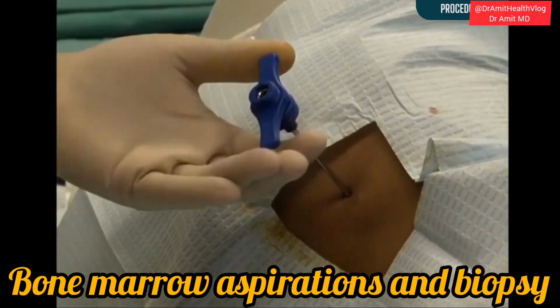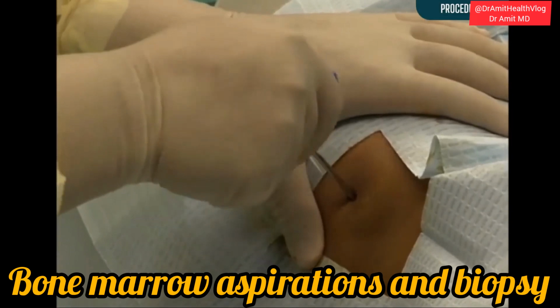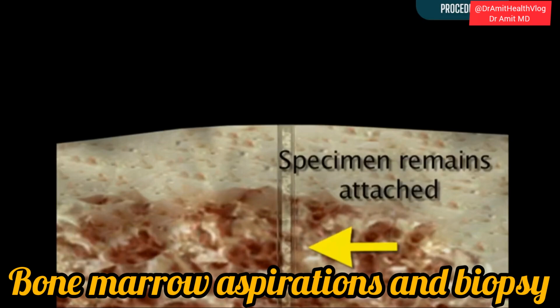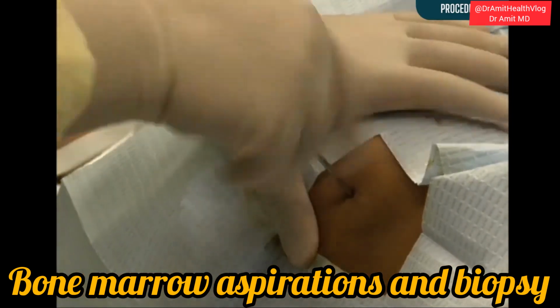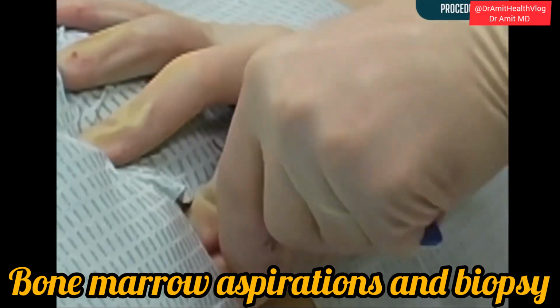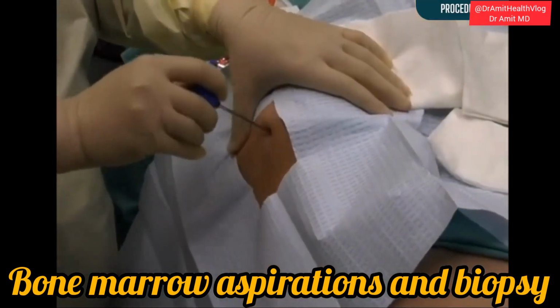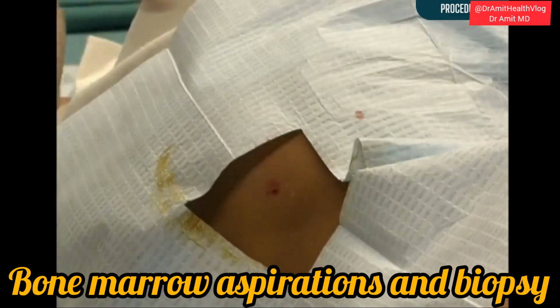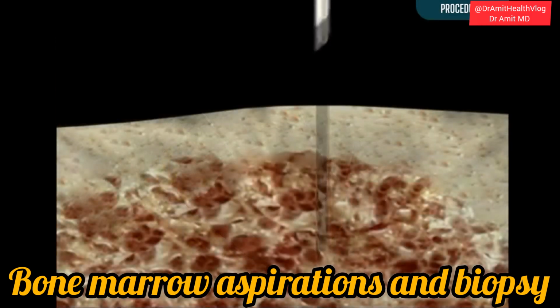In order to remove the biopsy specimen, it must be detached from the surrounding marrow and bone. Do not pull the needle straight out, as doing so may allow the specimen to remain attached to surrounding marrow and prevent it from being removed in the needle. Rotate the needle 360 degrees several times in both clockwise and counterclockwise directions prior to removal. The needle should then be rocked back and forth to ensure detachment of the specimen from surrounding marrow. Slowly pull the needle out while continuing to rotate.